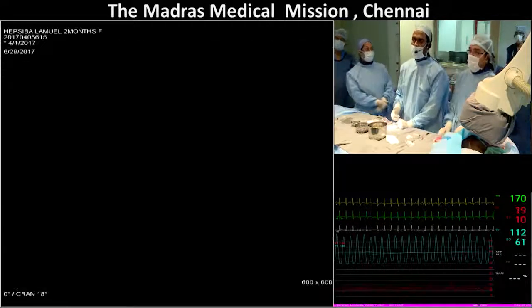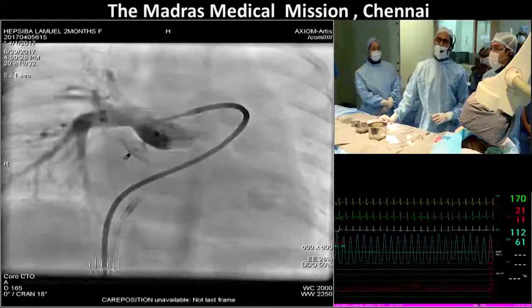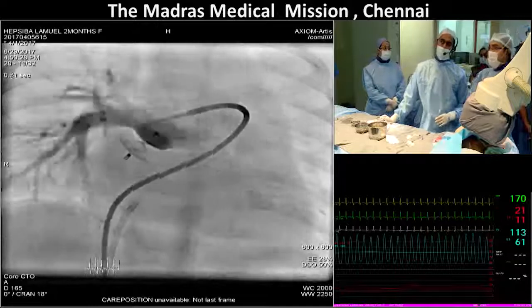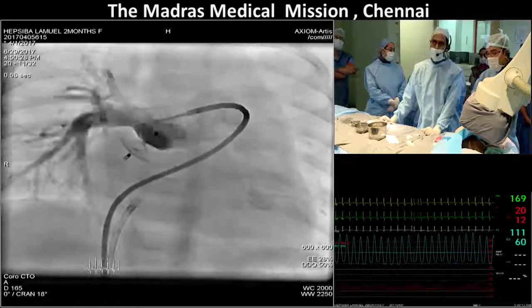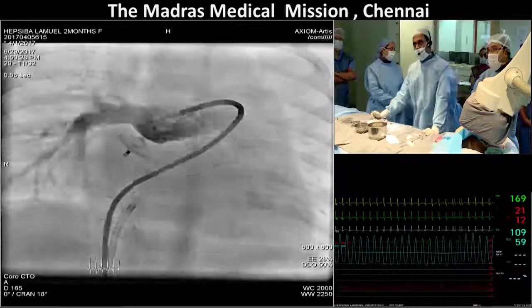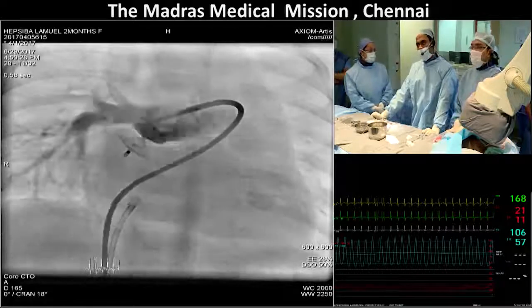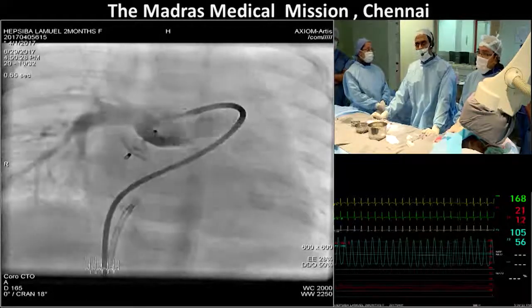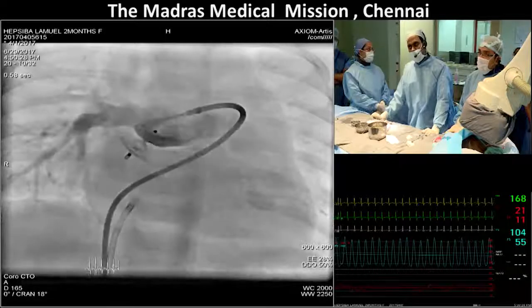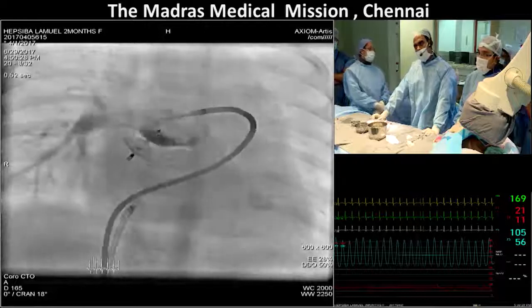I think that's a good question. The discs of the septal occluder will be about 6 millimeters more on the pulmonary arterial side if I am using a 4 mm atrial septal occluder. So it will make it 4 plus 12, that is almost 16 millimeters on the pulmonary arterial side, whereas this 5 millimeter duct occluder 2 will have 11 millimeter disc.